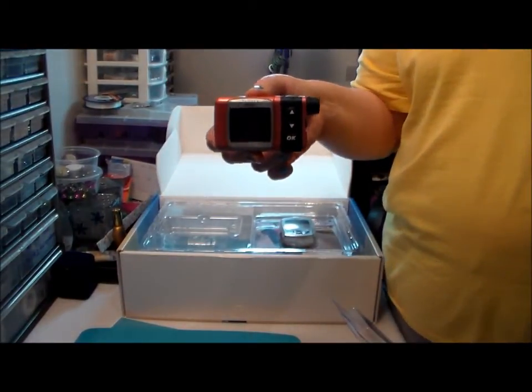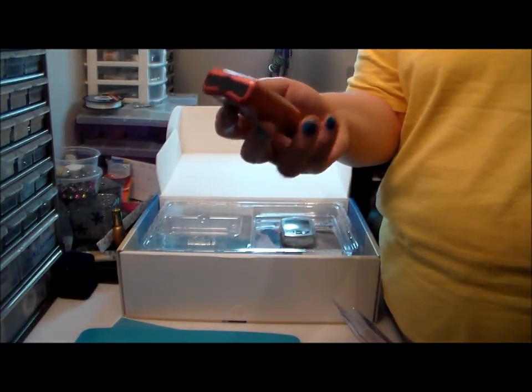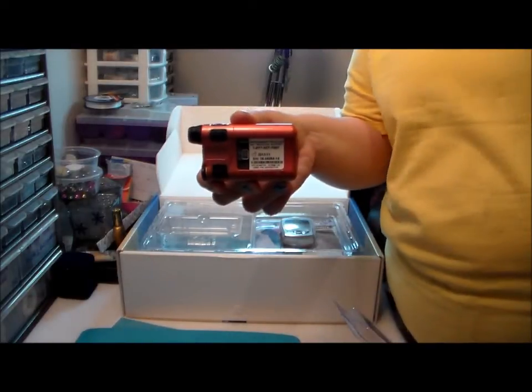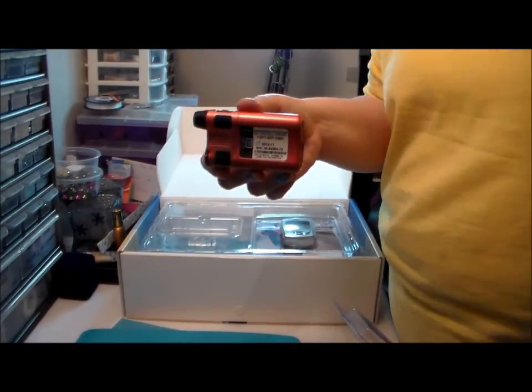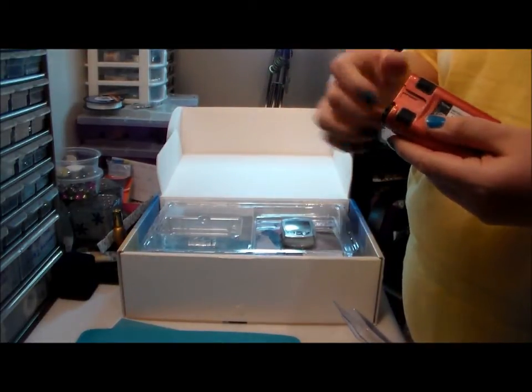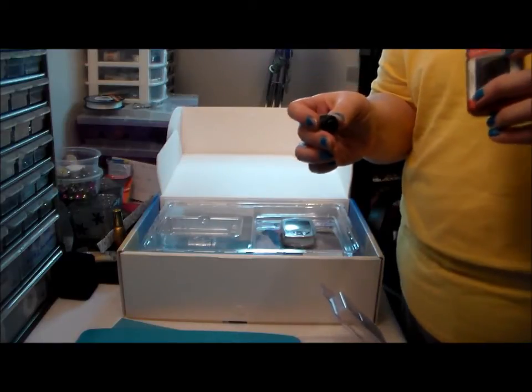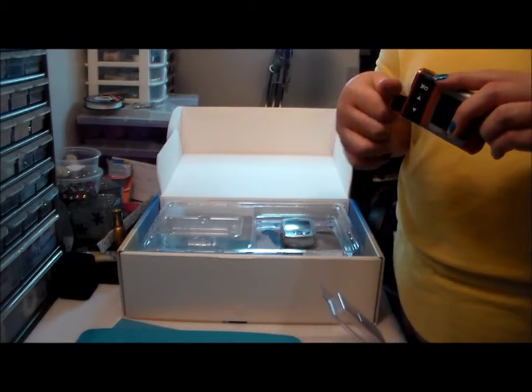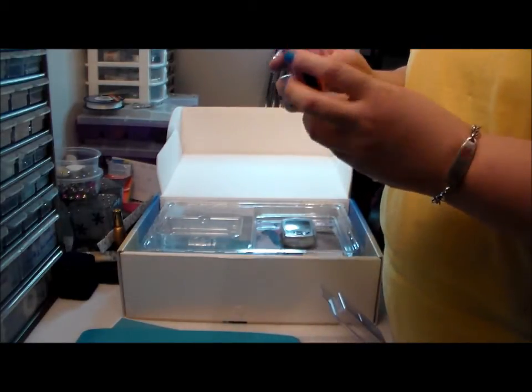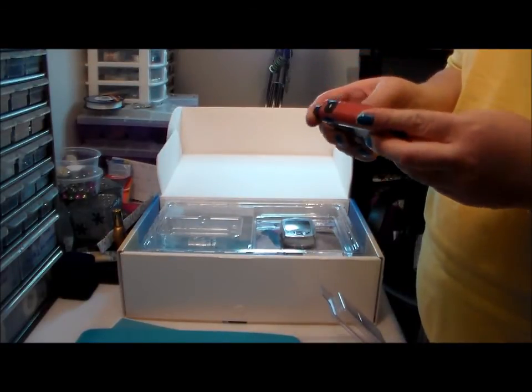Here it is — it's the pink one. I ought to think of a name for it. Here's what the back looks like. I ordered some screen protectors — that's why I ordered more of those, because I'm a klutz. I think that's the reset button or something like that.